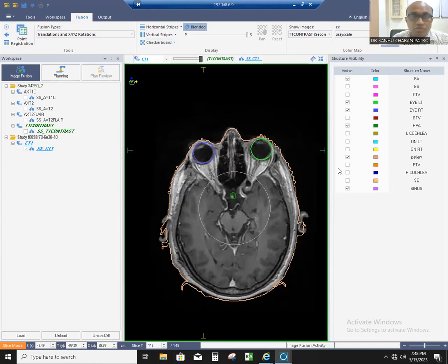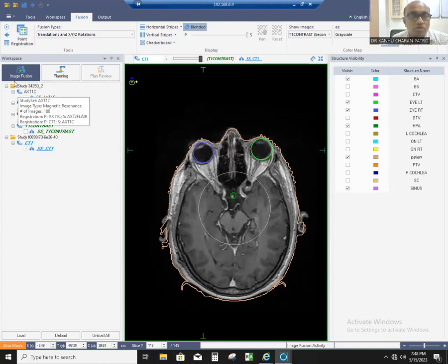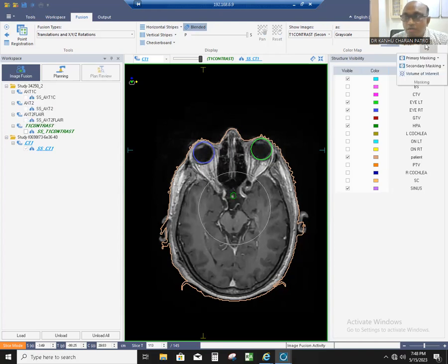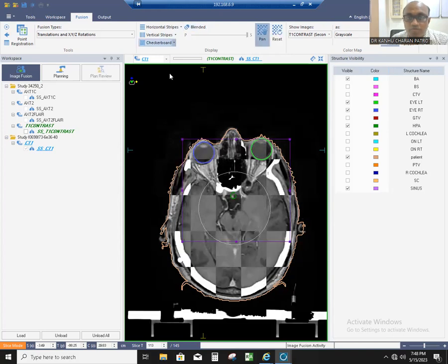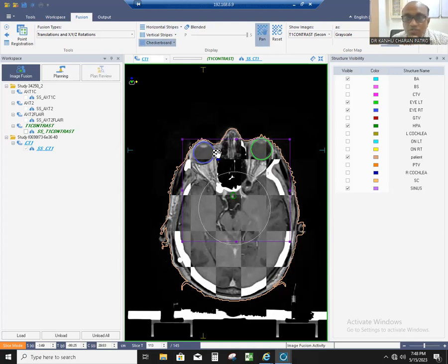This is all about CT-MR fusion. You can do it for any part of the body. This is called automatic fusion. If you want to use a part-of-area fusion, that is also available. You have to contour the eyeballs, sinuses, and other landmarks for proper fusion. Thank you very much.